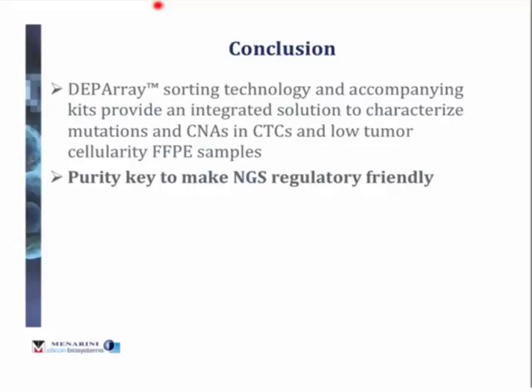And germline mutation is actually what the FDA and the other regulatory authorities are approving nowadays for the NGS system, because then you have a clear understanding. Whereas if you go for somatic, then you have very high bars in terms of purity in order to have reliable results. And with this, I would hand it over to Matthew.